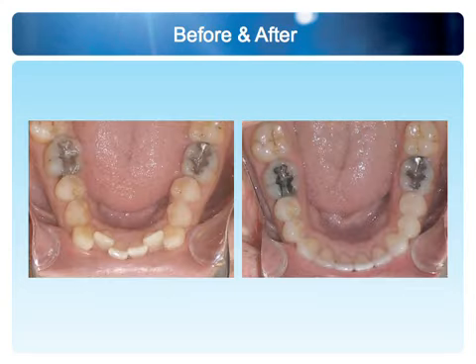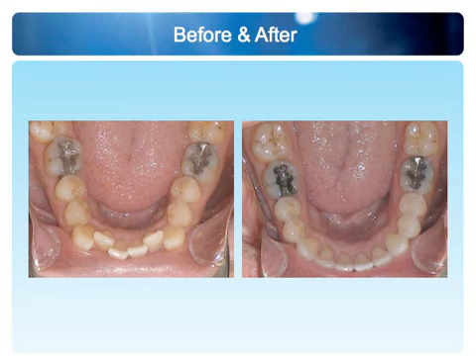The lower arch will follow. If we have done 28 aligners and spent 14 months shaping that upper arch and developing proper arch form and proper arch width, the lower teeth are going to upright. And the difference between before and after is huge, because this is a posterior segment that is set up to receive proper vertical occlusal forces. Because the buccolingual inclination on the lower is perfect. And on the upper arch too. And when you set that up properly, you can have nothing but improvement in your posterior occlusion.